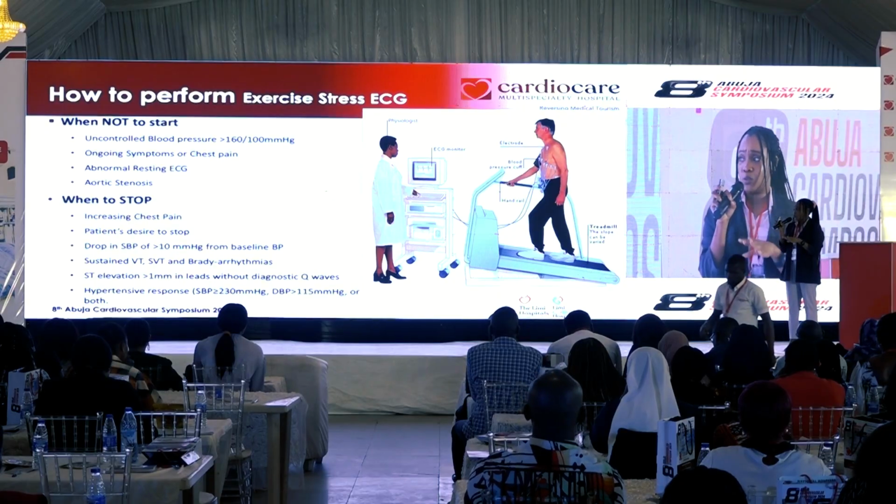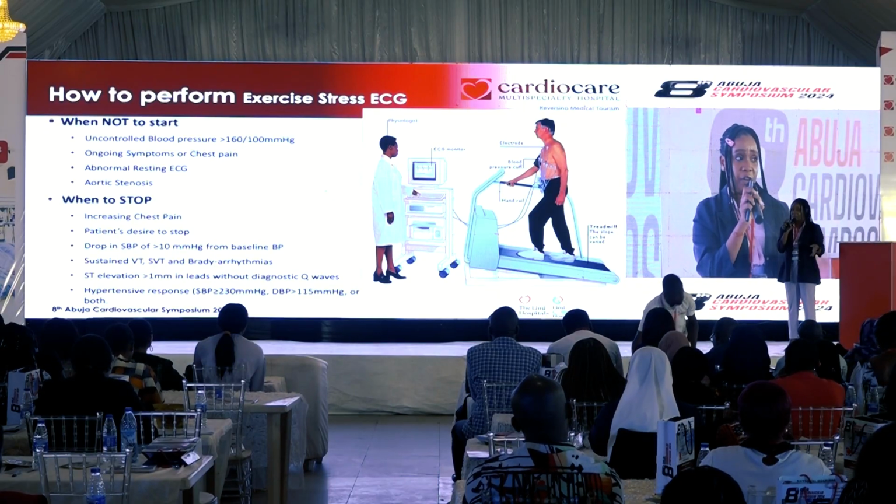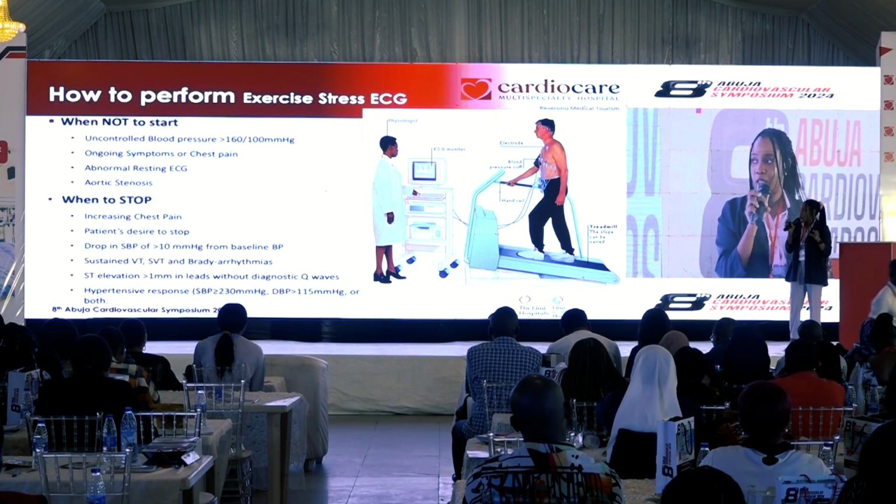A patient's desire to stop cannot be overemphasized. It's like someone on the treadmill is telling you, oh, I'm feeling some type of way, and you still want to push. It's good to motivate them, because sometimes some people can just be, I wouldn't say lazy, but yes, they can just be lazy. But you motivate them. But if they are complaining, oh, my leg is paining me, I'm feeling some type of way, we terminate the test immediately.